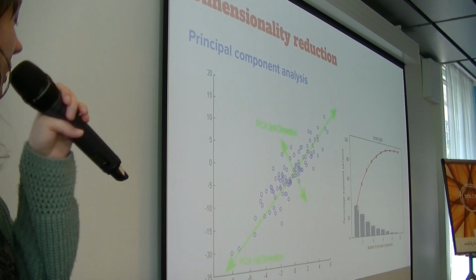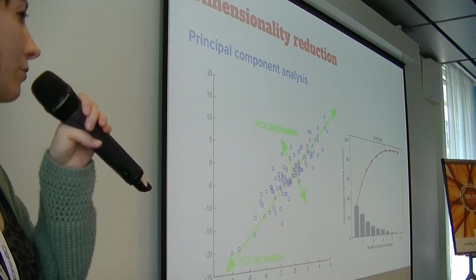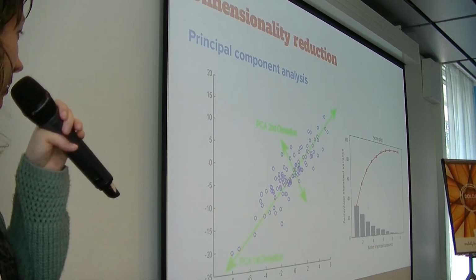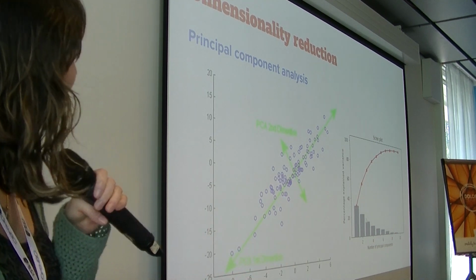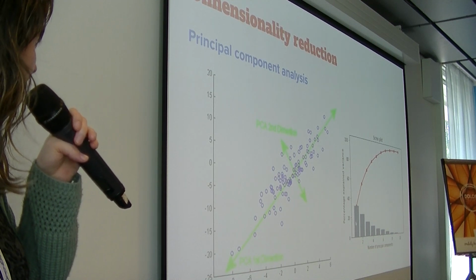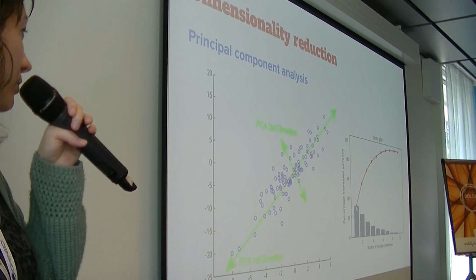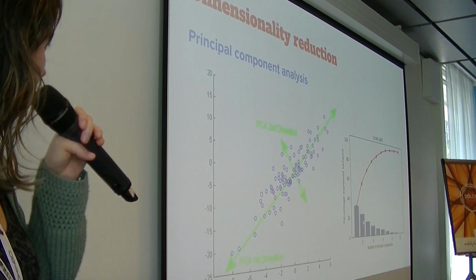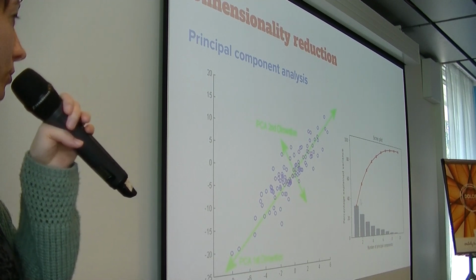And what you could also do is plot all of the components on your data and how much variance they explain in your data, if you have more than just 2 channels, but say 10 channels. Here you see that the first component would explain about 30% of variance, maybe 35, this one 21, so you see that they are ordered nicely. The first one explains the most.